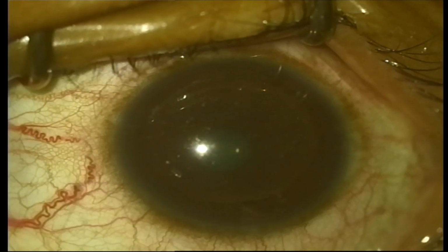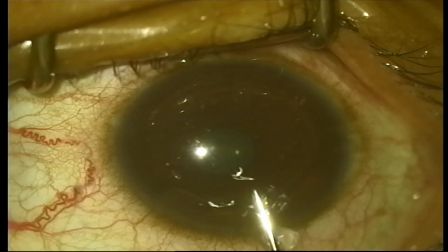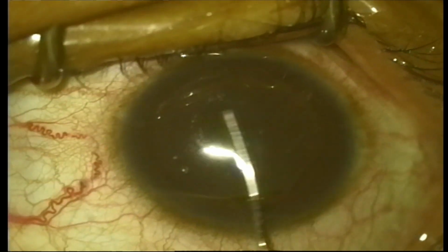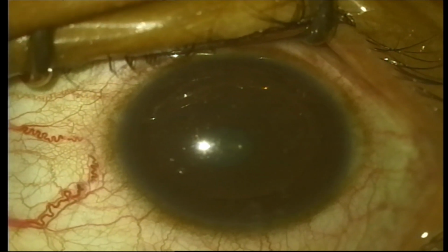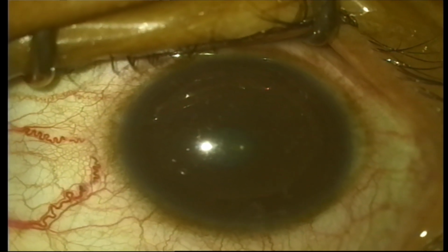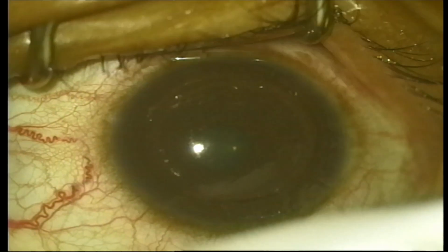I just tend to, it is freezing. Are you seeing it properly, Namrata? Yes, sir. Okay, it's visible very nicely, Dr. Agarwal. Beautifully done. But can you give us some tips to avoid such a loss?